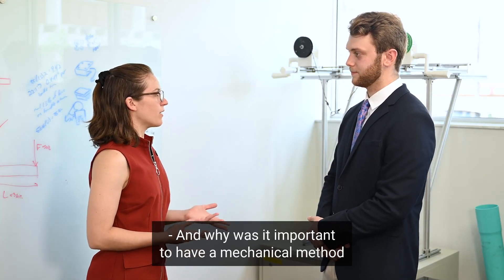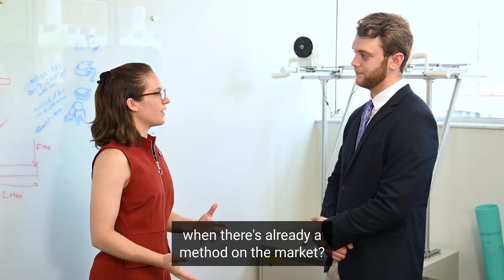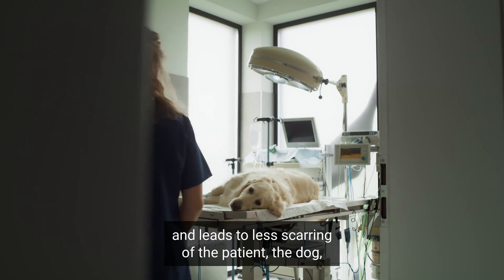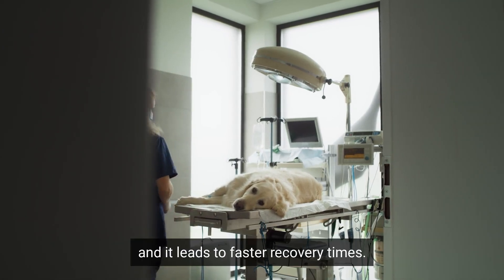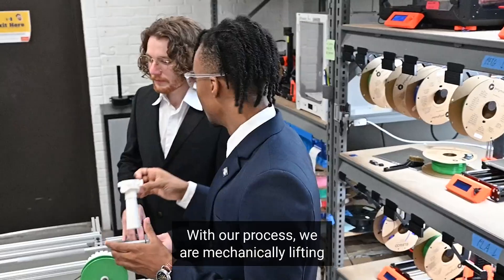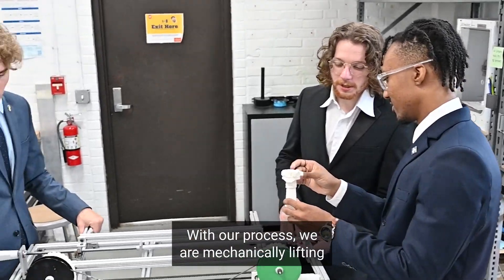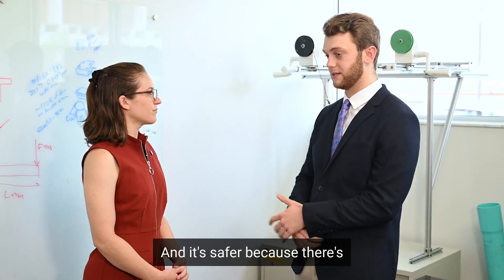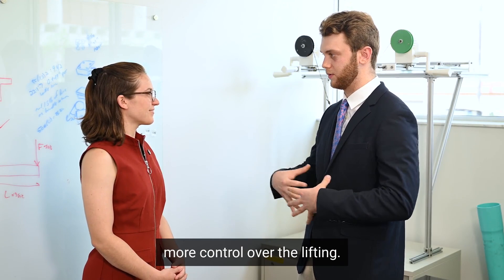And why was it important to have a mechanical method when there's already a method on the market? The mechanical method is much safer and leads to less scarring of the patient — the dog — and it leads to faster recovery times. With our process, we are mechanically lifting to give the same space that inflation would, just a different method. And it's safer because there's more control over the lifting.